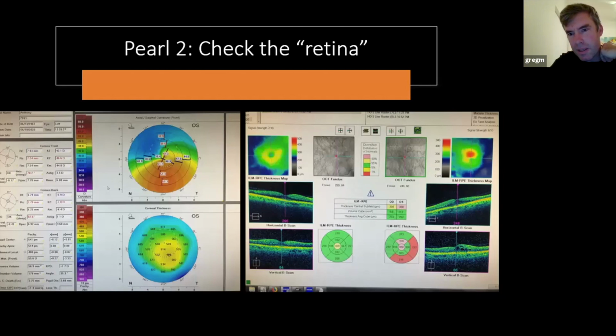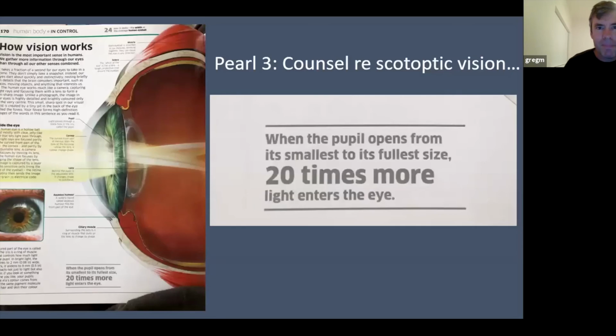And I think there has been early feedback from our retinal colleagues about this lens, which is generally supportive, that most retinal treatments can be conducted through an IC8 in place. But I'm still hesitant in my practice to offer that when there's a possibility of particularly focal laser, which is an increasingly rare intervention, but certainly diabetic or other retinal pathology in the central paramacular region.